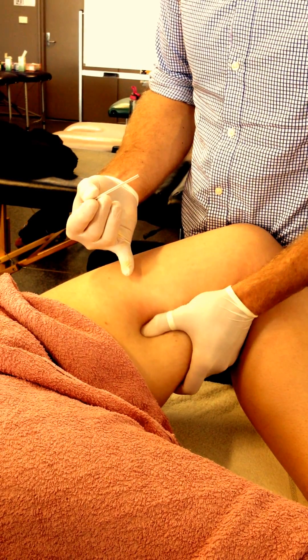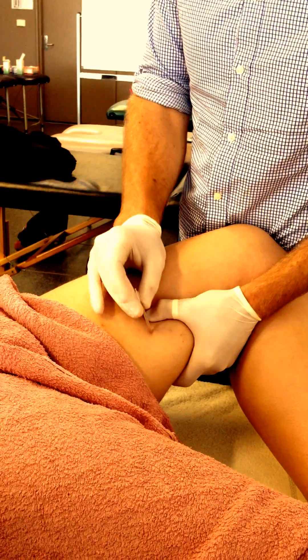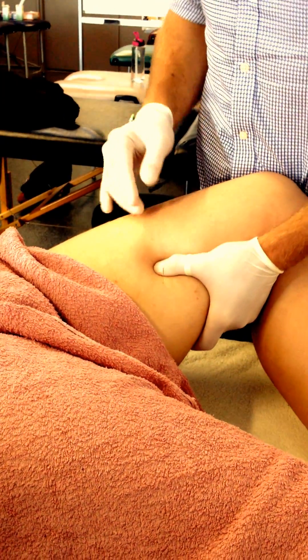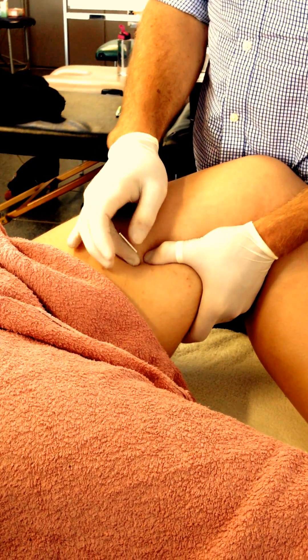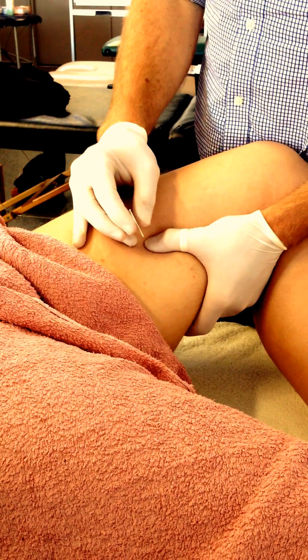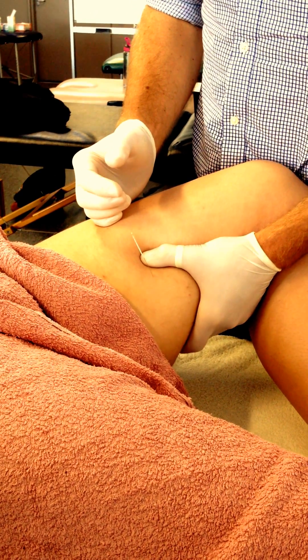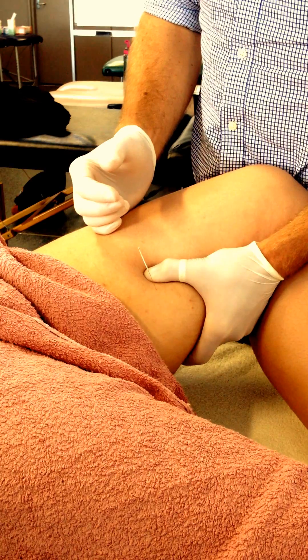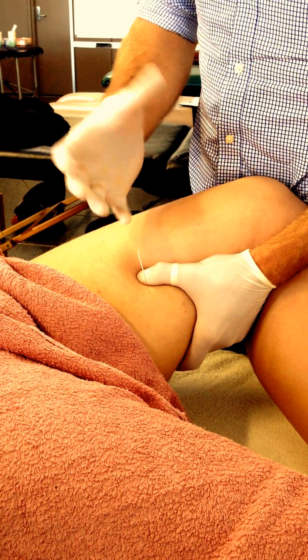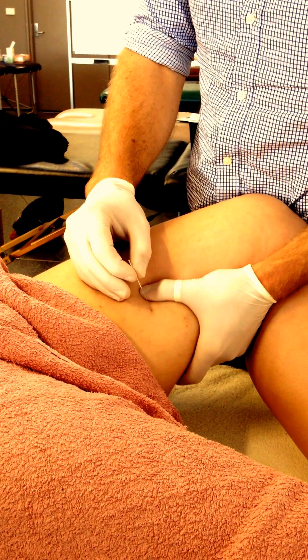So it can be quite tender for people. Depending on how deep you need to go, a 40 or a 50 is probably where you'd be looking. Some people you might need a 75 as well. Don't have it really heavily grasped — just sort of have it held and pulled away gently. But if you've got it really firmly grasped, well it's painful, but also you're putting tension on everything there so the needle won't pass through the tissue quite as well.